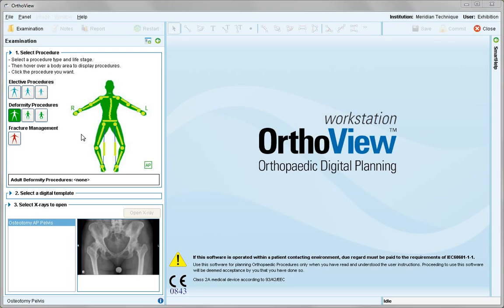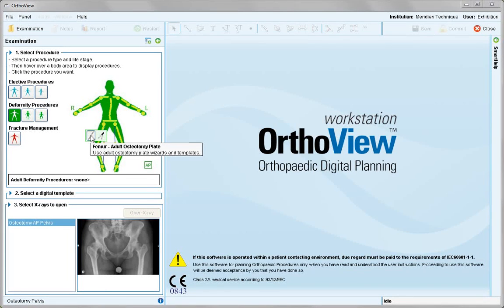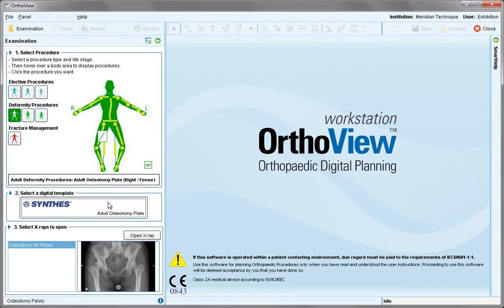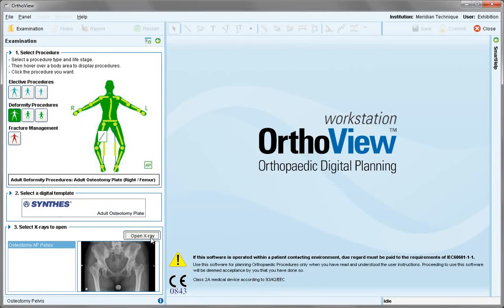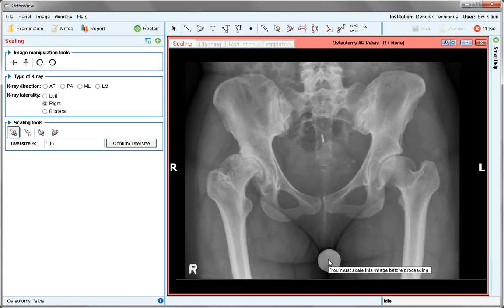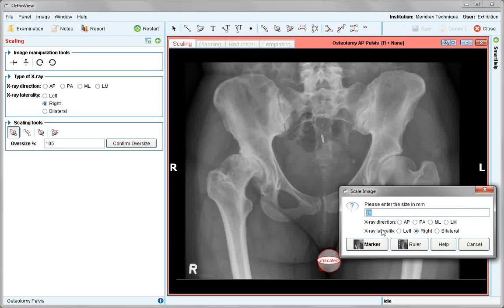In the Deformity module, hover over the femur and choose from the plate symbol. The adult osteotomy plate appears — open the X-ray and scale the image.